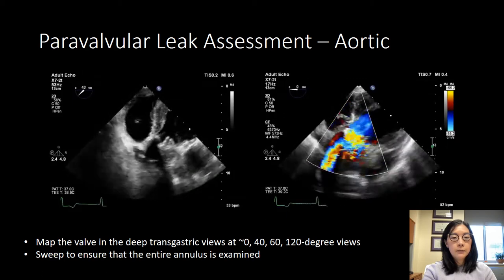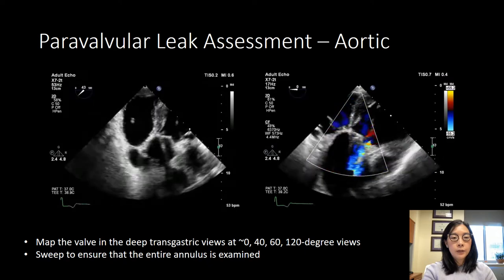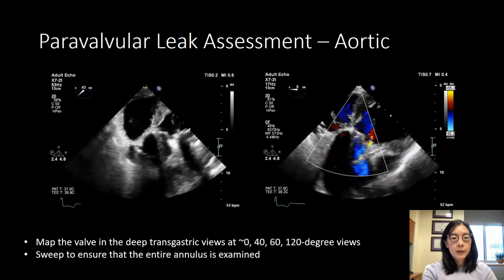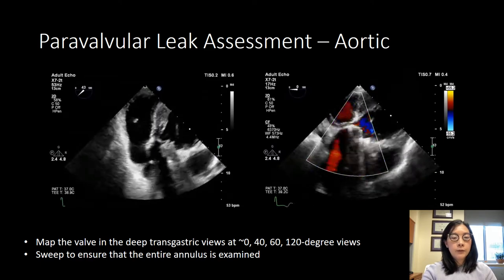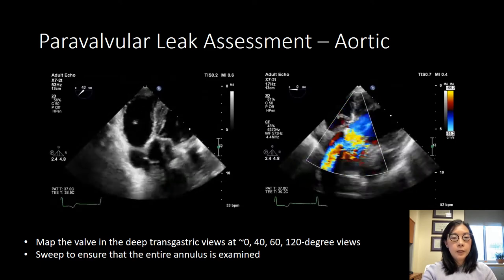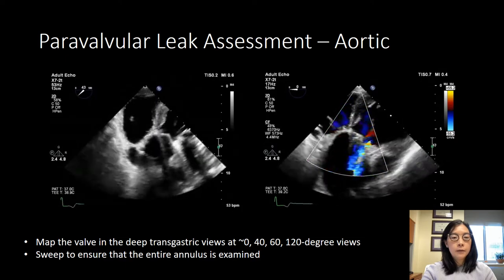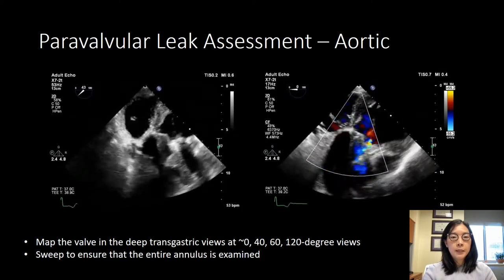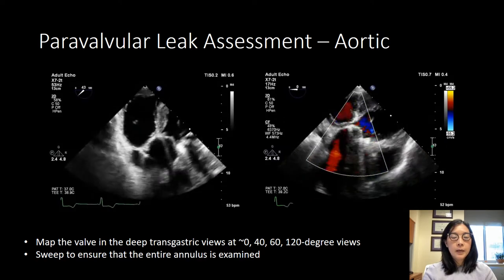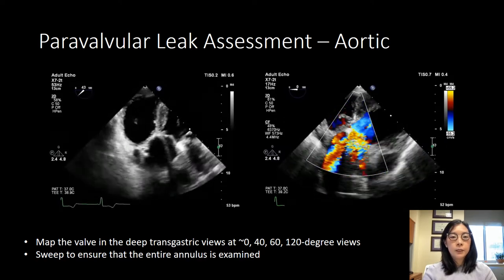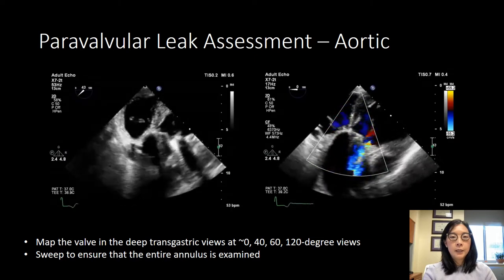For mechanical valves, you want to see the leaflets in parallel so that you can ensure that they're opening and closing properly. The transgastric views are particularly valuable for the aortic valve as there can be shadowing of the anterior annulus in the mid-esophageal views and so jets in that area may not be seen. We try and do sweeps in order to make sure that the entire annulus is visualized and all jets are accounted for.